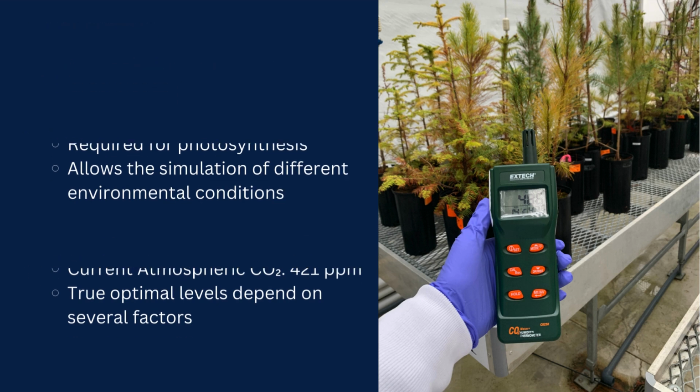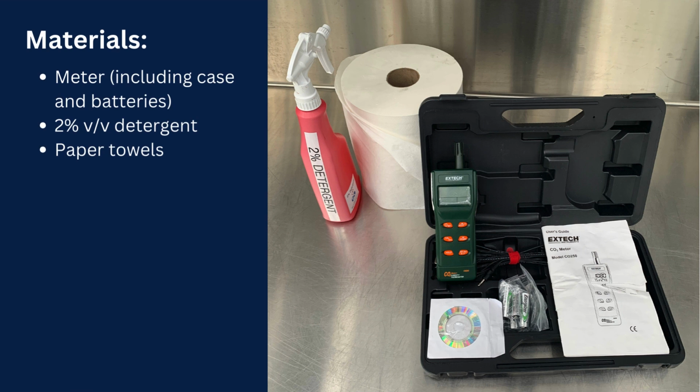To properly use this meter, you will need the meter, including the carrying case and provided batteries, a 2% detergent solution, and some paper towel.